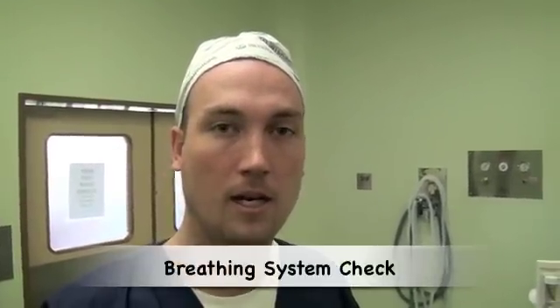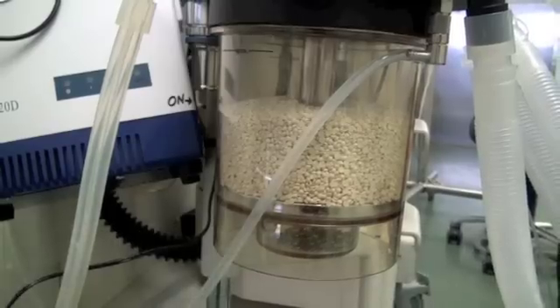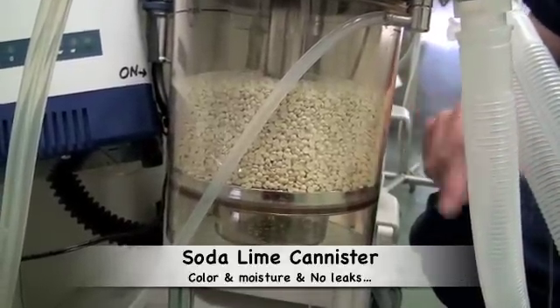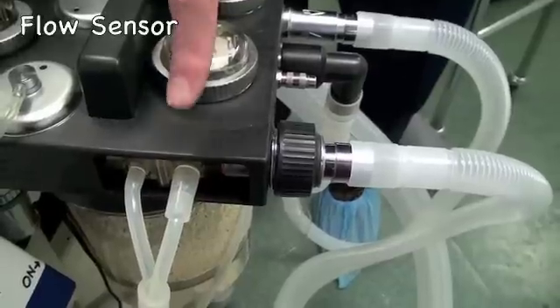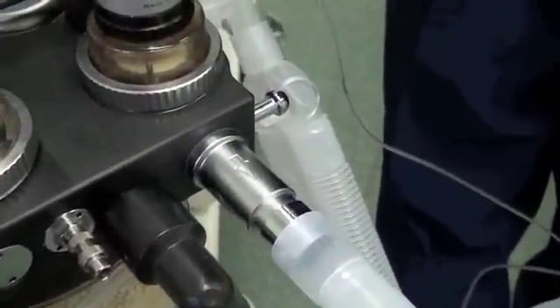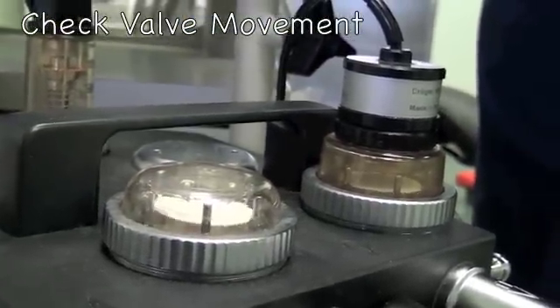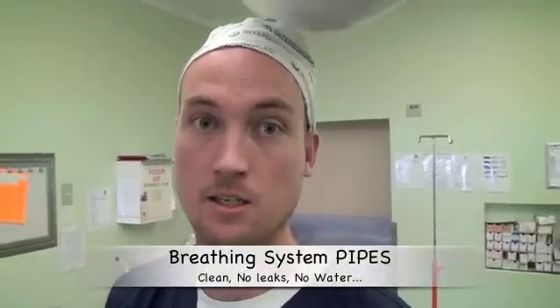Having checked the function of the anaesthetic machine, one now needs to check the integrity of the breathing system. This machine has a circle system with a CO2 absorber. One needs to check that the soda lime within the CO2 absorber hasn't changed color, that there isn't too much moisture, and that it is seated correctly without any leak. Other components include a pressure sensor and a flow sensor, which must be connected appropriately to the breathing circuit and to the back of the machine. There are two limbs — inspiratory and expiratory — each with its own valve, the function of which must be checked by squeezing the bag and watching for valve movement. The piping must also be checked to ensure it is clean, has no leaks, and contains no water.